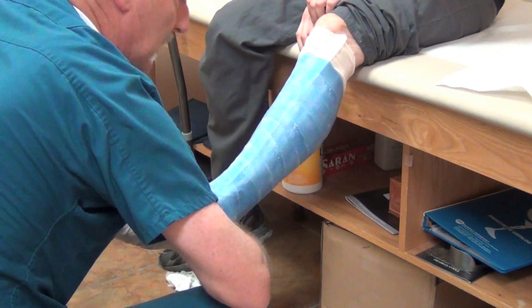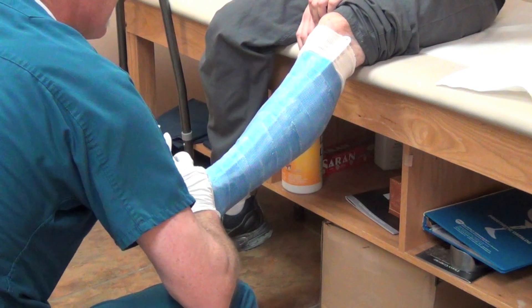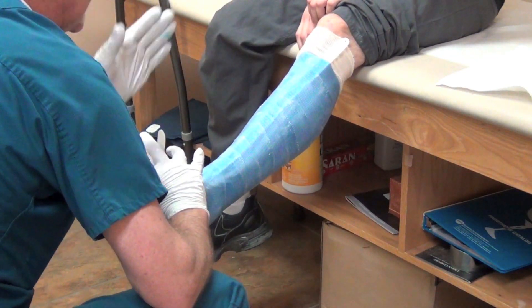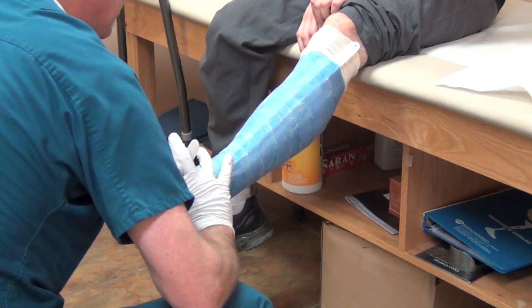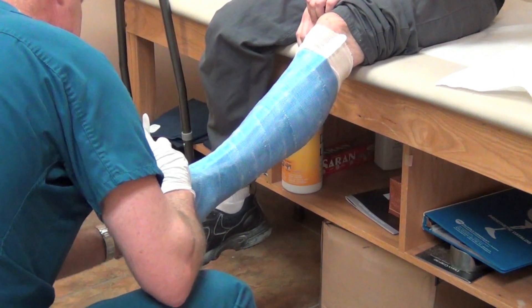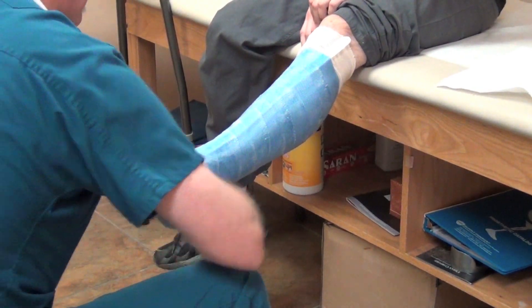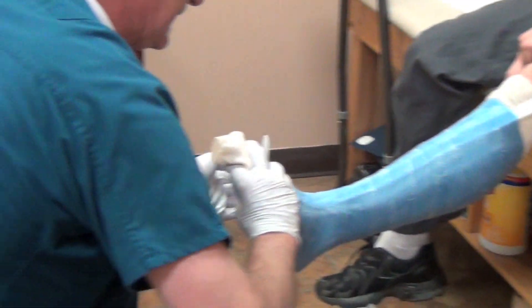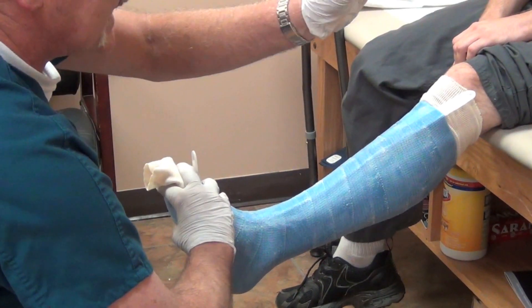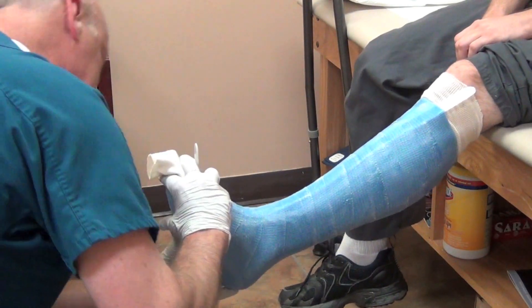Relax your leg. I want to dorsiflex the foot — I'm not concerned with a 90-degree angle; I'll fix that on the bandsaw. It's also important that we line the foot up in line of progression. I like to use the second toe in line with the knee — that will give me slight toe-out, which is very important. If you just have the foot turned out, that will not correlate to line of progression. Then I dorsiflex the foot to maintain that angular relationship. I can use the tips of my fingers to pronate the forefoot or my whole hand to supinate it, maintaining the forefoot balanced. With my other hand, I'm massaging into the ST groove, with my thumb highlighting the lateral arch and my forefinger highlighting the ST groove.